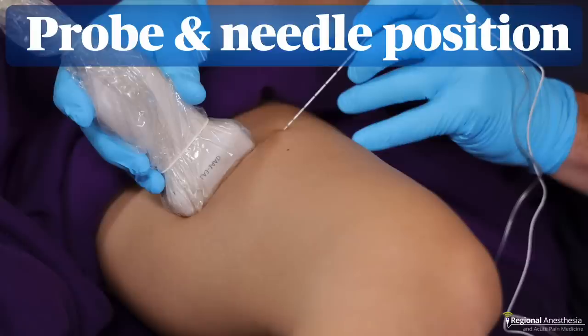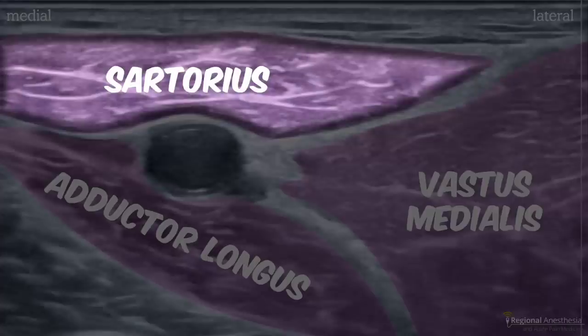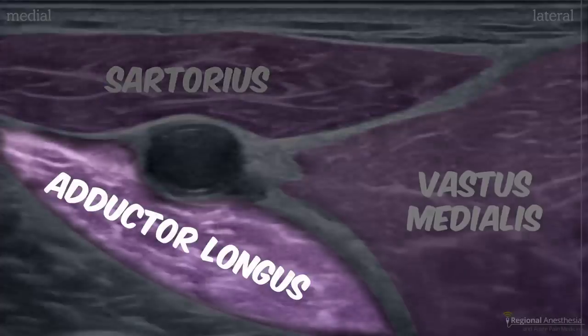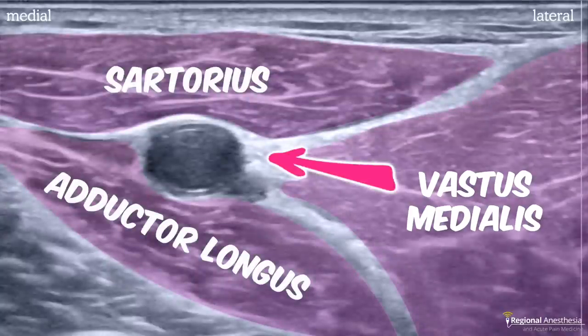To image this area, we're going to place a linear probe on the anterior medial thigh, right about halfway between the inguinal crease and the patella. It helps to have the patient's thigh frog-legged a bit to expose the medial side, and our needle is going to be advanced from the lateral aspect. The first sonographic landmark we're going to see is the circular femoral artery. There's a vein there too, but it's often squished flat by the pressure of the probe. The sartorius muscle lies superficial to the vessels, the adductor longus deep, and the vastus medialis muscle is on the lateral side. The hyperechoic structure immediately lateral to the artery is the saphenous nerve.